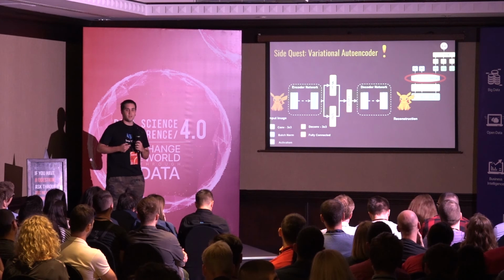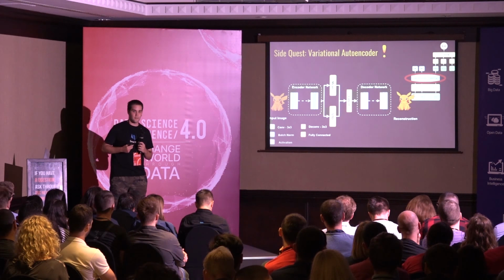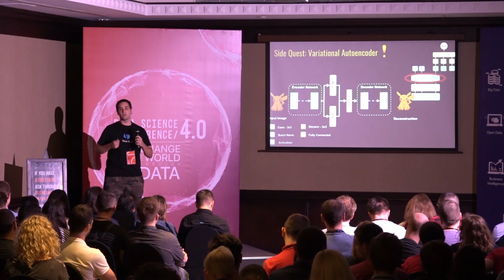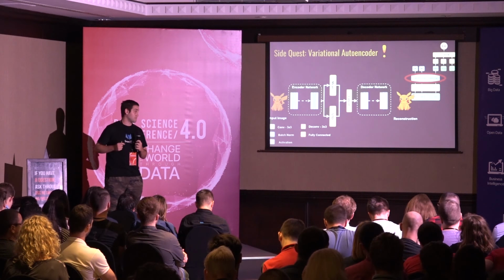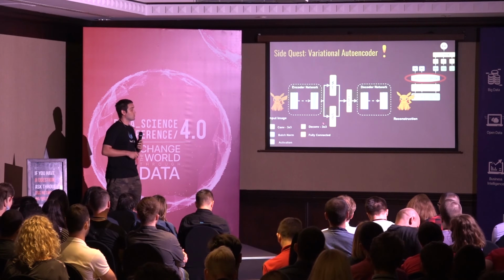What is bad with plain old autoencoders is that the extracted features are so diverse. For example, one value can be -100, the second value can be 1000, etc., with some gibberish in the middle. So what does a variational autoencoder do?